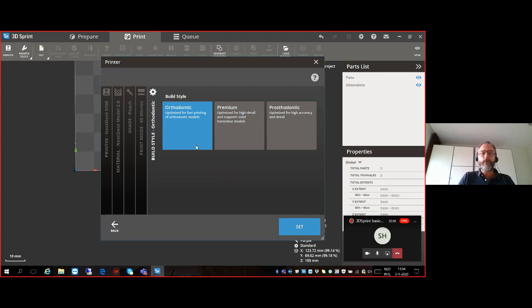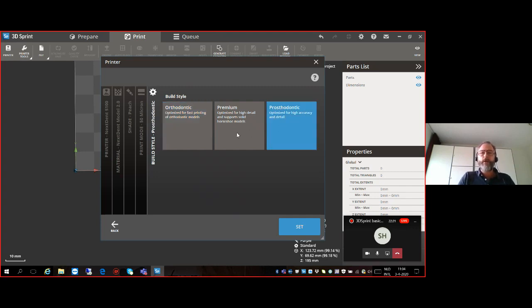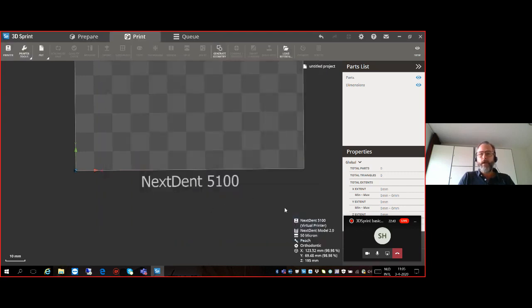We continue to the build style. We have three different build styles: Orthodontic, optimized for fast printing of orthodontic models; Prosthodontic, on the right, optimized for high accuracy and detail; and Premium, added about a month ago, optimized for higher detail and supporting solid horseshoe models. For this demonstration I'll select Orthodontic. Once everything is selected, click the Set button. In the lower right corner you can now see the selected printer, material — Next Dent Model 2 — 50 micron build layers, peach color, and orthodontic build style.